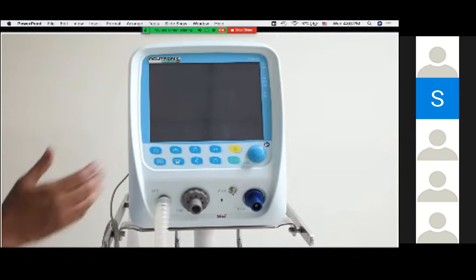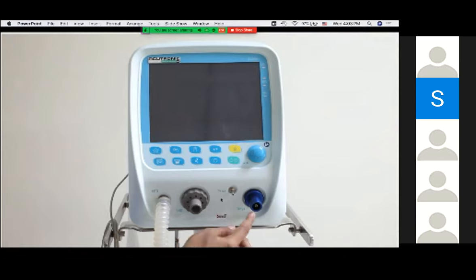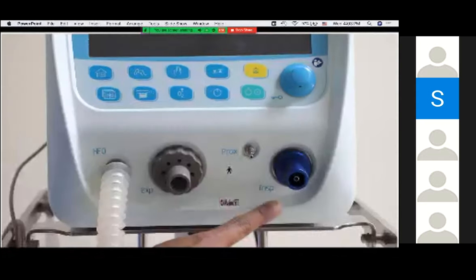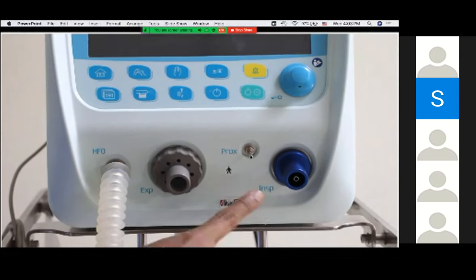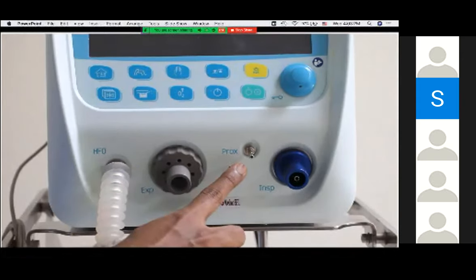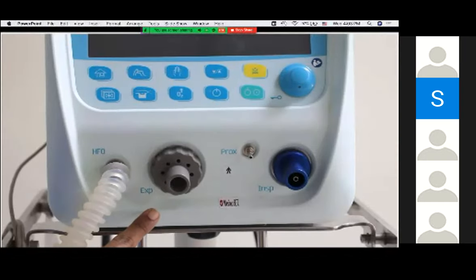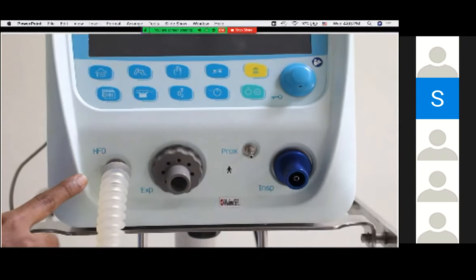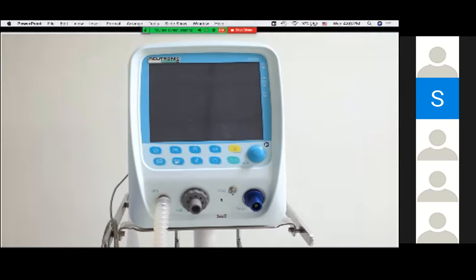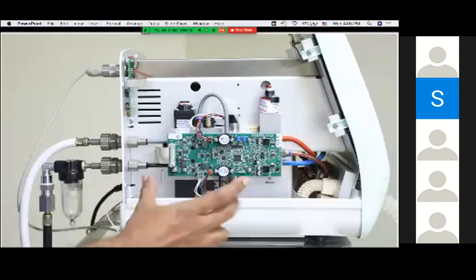This is the front part of the ventilator, which has four important ports and a screen. The blue one is the inspiratory port — inspiratory gases exit from this port, enter the humidifier, then reach the patient. There is a prox port where we attach a pressure sensor, and an expiratory port where exhaled gases enter. This port is for high frequency ventilation — when a baby is on HFV, it is attached to the inspiratory circuit, which I will show in the circuit demonstration. This is the blender assembly of the ventilator.